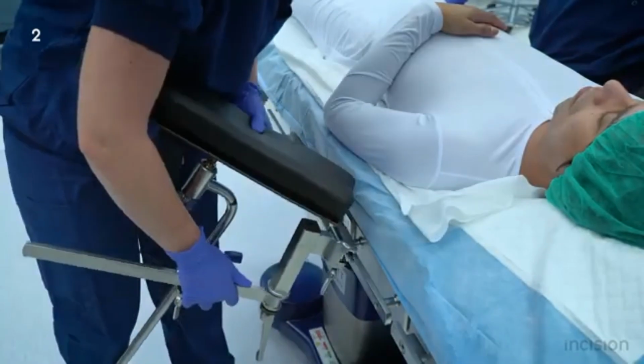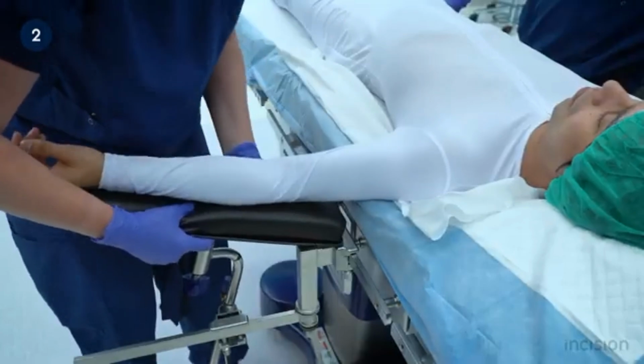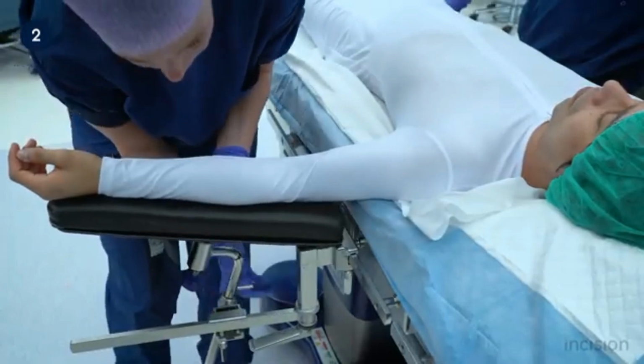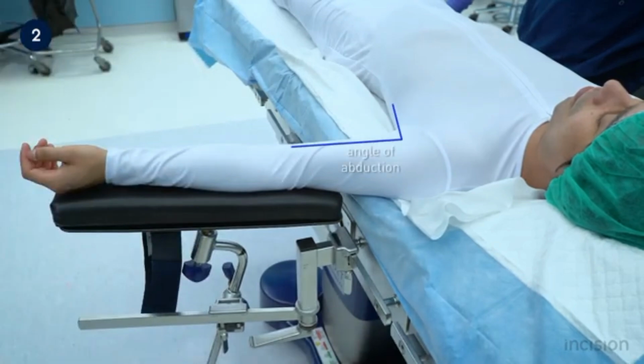Alternatively, the patient may be positioned with their arm abducted away from their body. An arm support is attached to the surgical table. The OR team member then places the patient's arm on the arm support while making appropriate adjustments to ensure patient comfort and safety. With adjustments completed, take note of the angle of abduction. This angle is kept below 90 degrees to avoid stretching the axillary nerve and potentially injuring it.